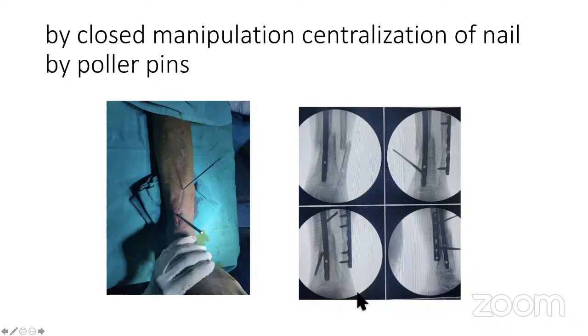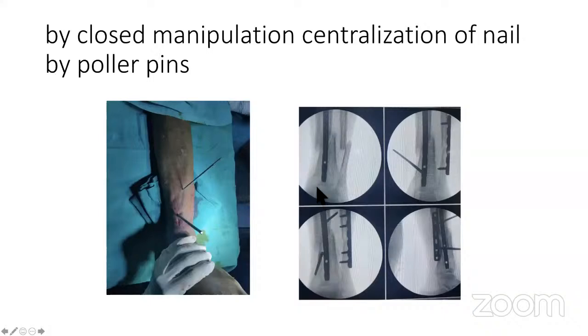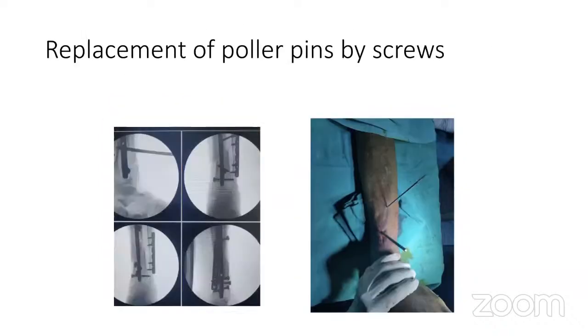You can see I tried to translate the distal fragment by putting this pin here. This is the proximal pin, translating the proximal fragment and then centralizing the nail in the distal fragment. You can appreciate that there is some correction. The translation has been corrected, and then I translated the nail also. The translation of the nail is done by a Poller pin. We put a Poller pin, slowly hit the nail, and then correct it by putting the second pin here. So this is how it is.